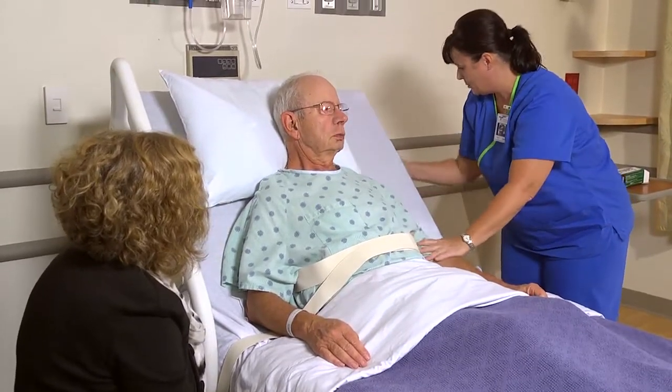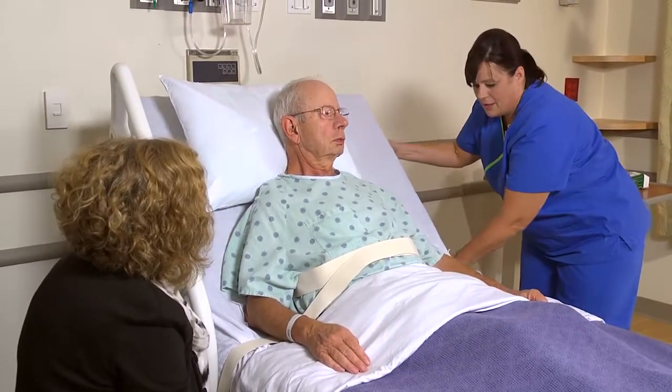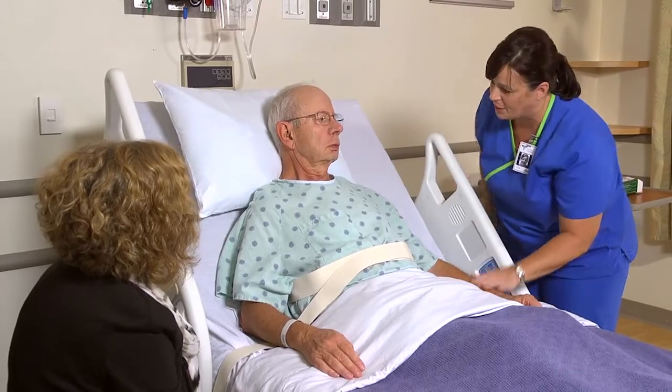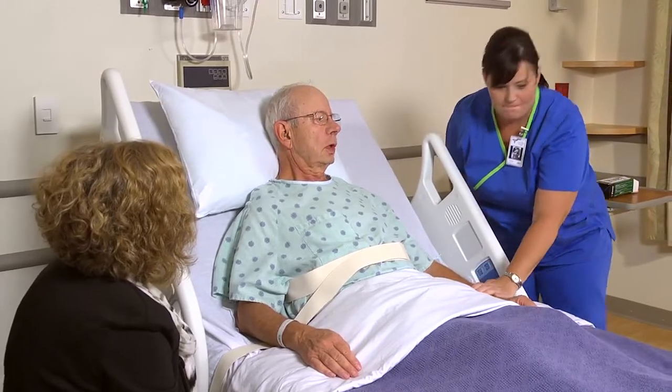I'm going to bring your side rail up. I'm going to go on the other side and do it as well.